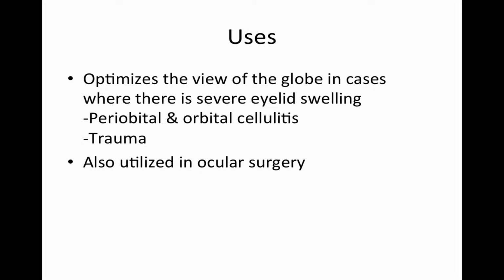In the next slide, I will go over my own personal technique of how to put in a lid retractor in the clinic. There are many different variations in how to use an eyelid retractor, and of course there are many different types of eyelid retractors out there. This is just one technique, but as I mentioned, there are many different ways of doing this.